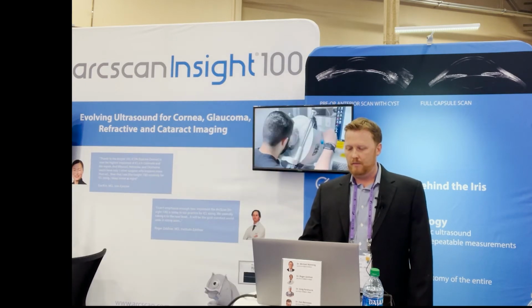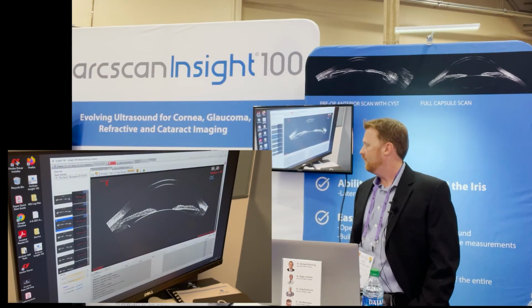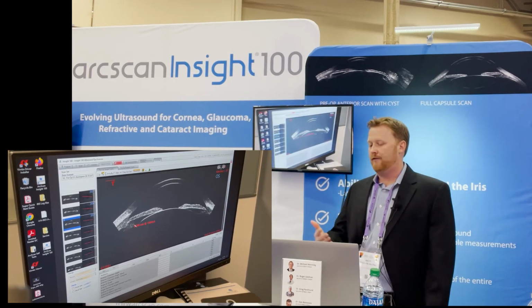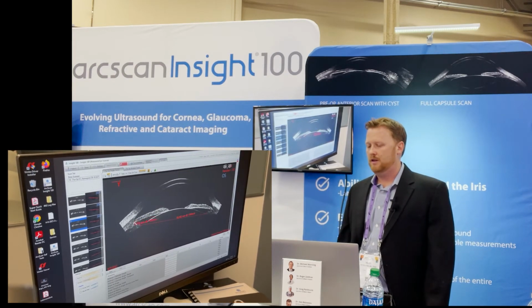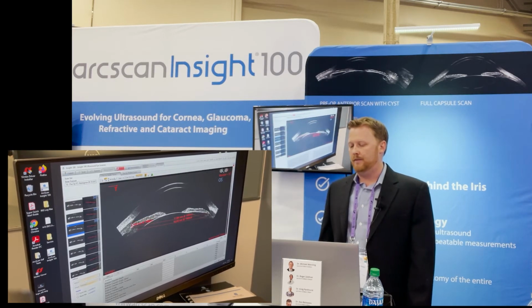So now, what I'm going to demonstrate too, so this is another video, once you've got the images and how fast and how quick and how accurate we are able to take 7 different measurements inside the eye, that has enabled us to put them into an ICL nomogram so that we can get the correct ICL size. And once you get used to it, you can accomplish this in under a minute. So the way that I like to do it is, at first, you go ciliary body measurements. Then you go sulcus to sulcus. Then take the angle to angle measurement.